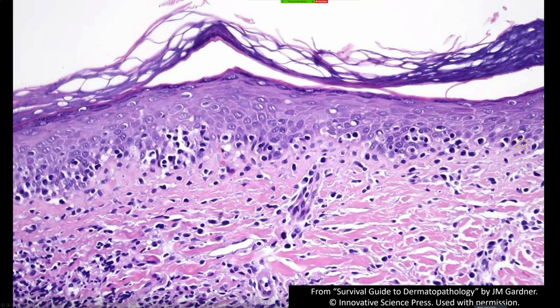So anyway, back to what we're seeing here: we've got the lymphocytes and they're tagging, scattered right along the basal layer of the epidermis here. When they do this, they tend to get little vacuoles around them. Sometimes we call those halos. And so this tagging of lymphocytes with halos around them along the basal layer is really helpful. Well, you might say, if you're savvy at DermPath, hey, that looks kind of like vacuolar interface dermatitis. You're right, it kind of does.